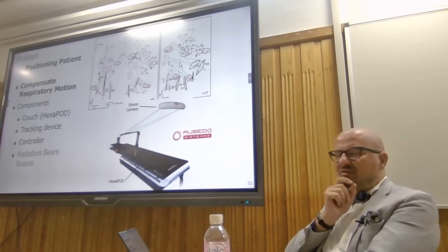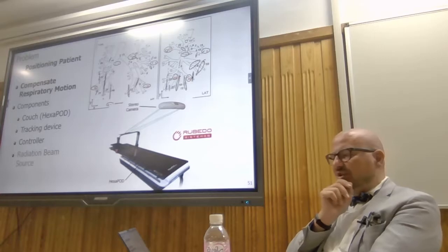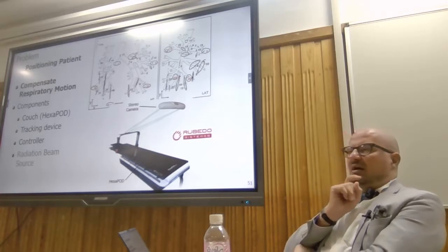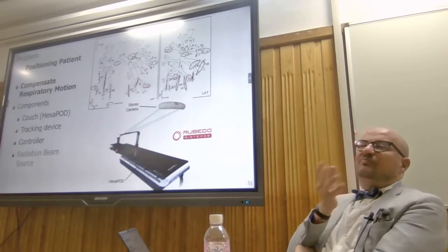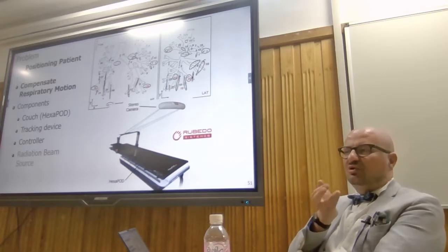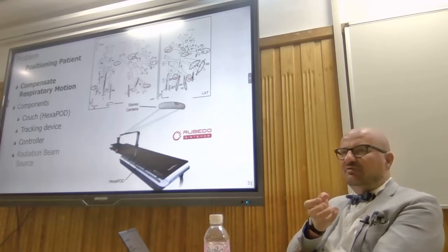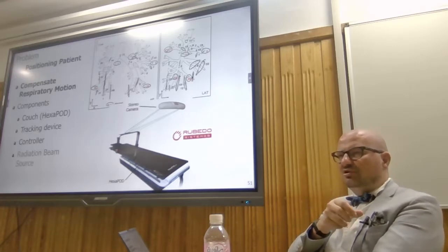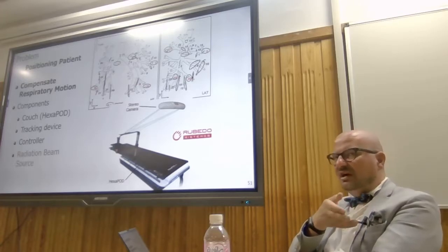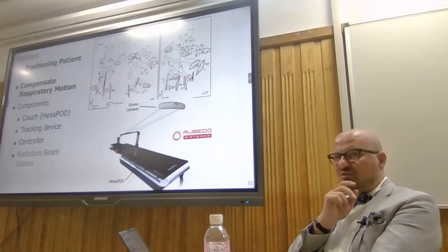So the idea is that when you have radiotherapy in the lungs area, actually your body moves quite a lot. And if you have radiation therapy, it means that your condition is not good already. And in addition, if you want to irradiate, especially smaller tumors, of course you want to irradiate only the tumor. You don't want to attack healthy tissues as well. And when you breathe, actually your body can move quite a lot.